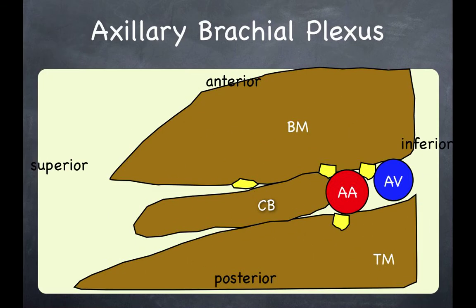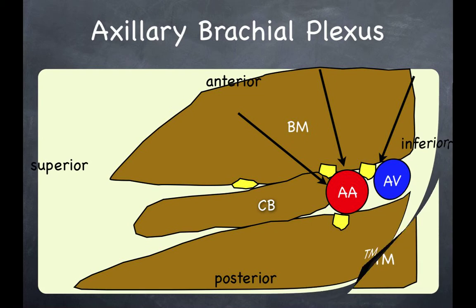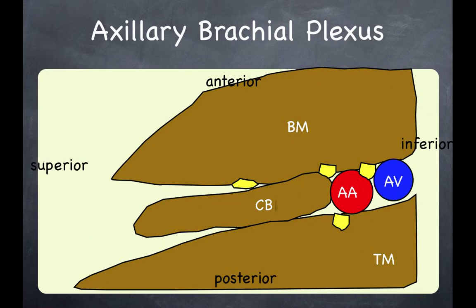Needle placement will be determined entirely by the anatomy of each individual patient. It can occur from inferior, anterior, or superior, as long as contact with the nerve itself is strictly avoided. Axillary brachial plexus block can be performed in an in-plane or out-of-plane approach. Usually, your needle position is assessed by local tissue movement and the spread of local anesthetic. In order to avoid undesired contact with any nerves or vessels, we advance the needle slowly.